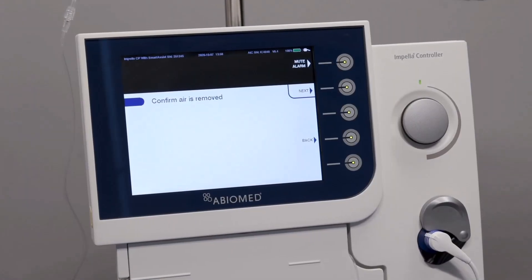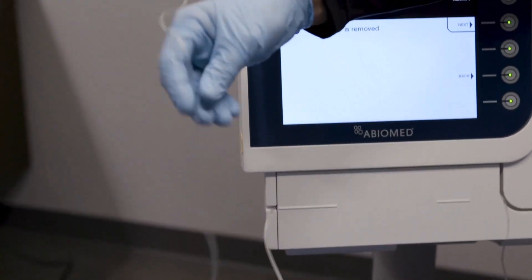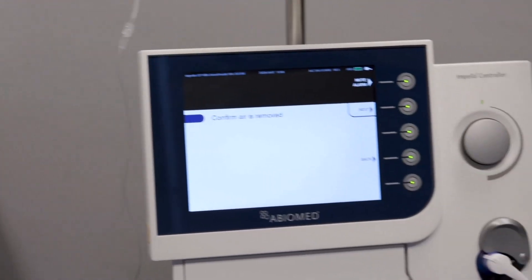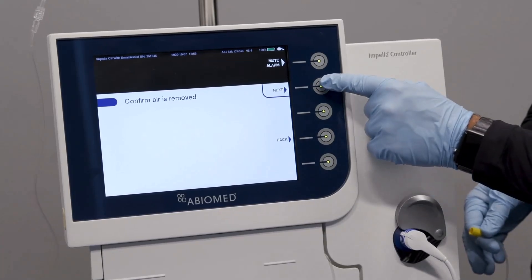Inspect the purge tubing and confirm that there is no air within the tubing. If air is observed in the tubing, press the back button to repeat the de-air process. Once confirmed there is no air, press next to advance to the next step.